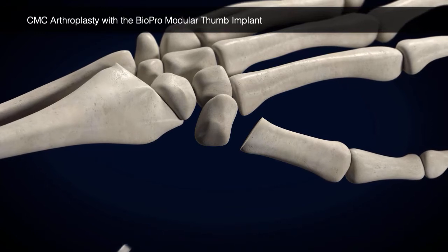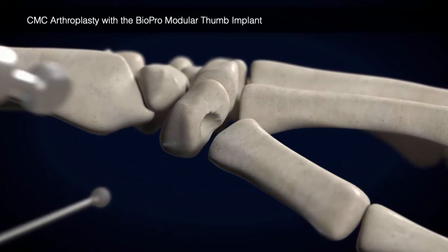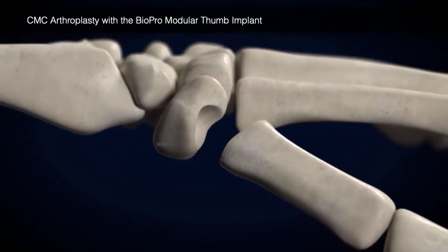With the 5-6 mm rotary bur, beginning in the center of the trapezium, form a socket. Finish the socket with the provided hemispherical burrs, corresponding to the available head sizes of the Modular Thumb Implant.